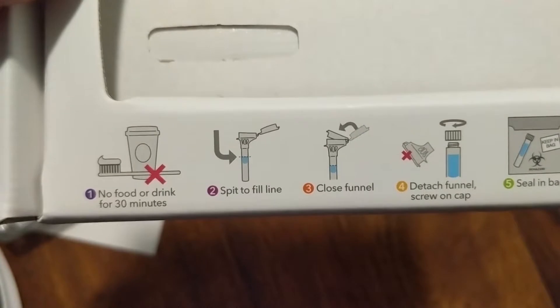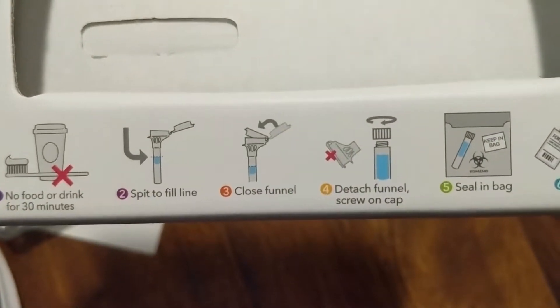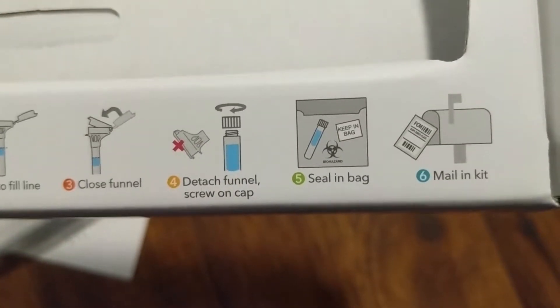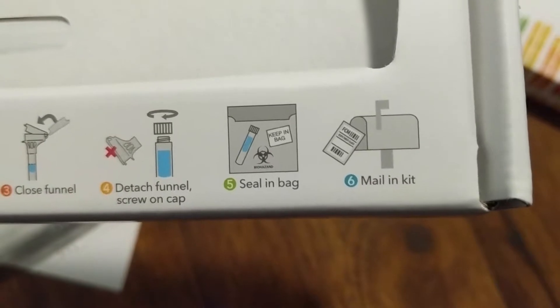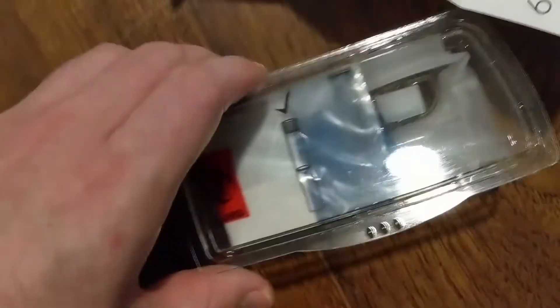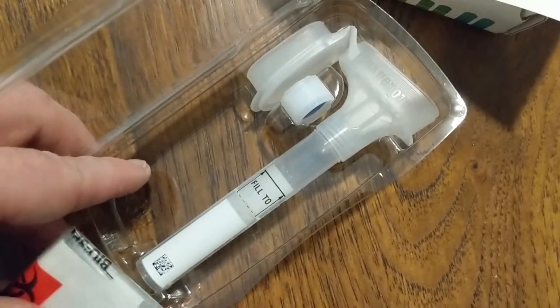No food or drink 30 minutes before you spit in the tube. You got to spit into the fill line, close the funnel, then detach the funnel where you're spitting in. Seal it in a bag and mail it out. There's the instructions again. Inside the kit we got the tube, the cap, and the bag to send it out in.